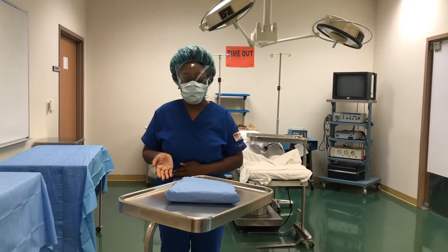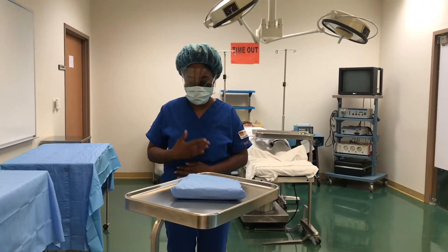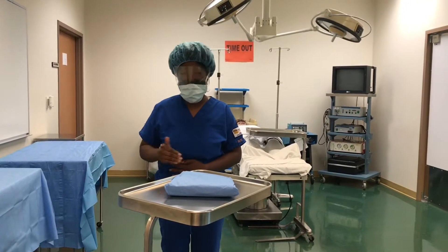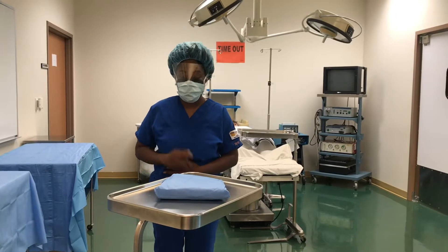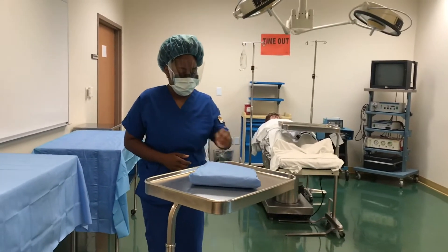When it comes to opening up your gown on the Mayo, you want to be very careful to make sure your scrubs do not touch the Mayo stand, because this is considered contaminated. I'm going to show you how you will go about that.